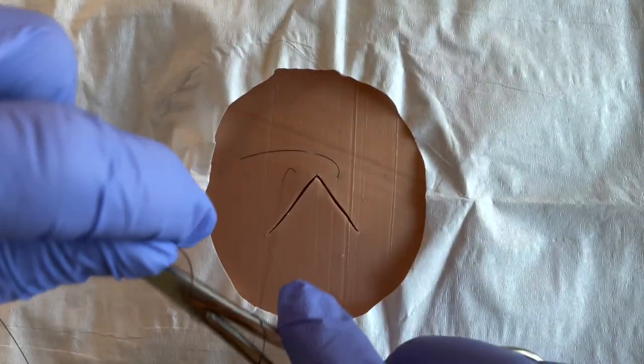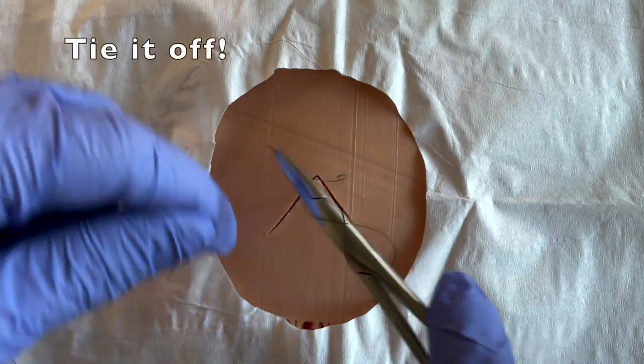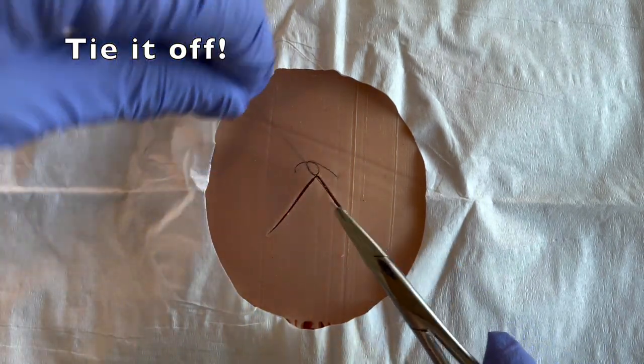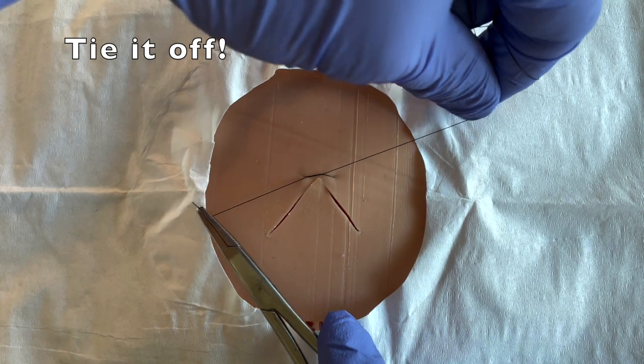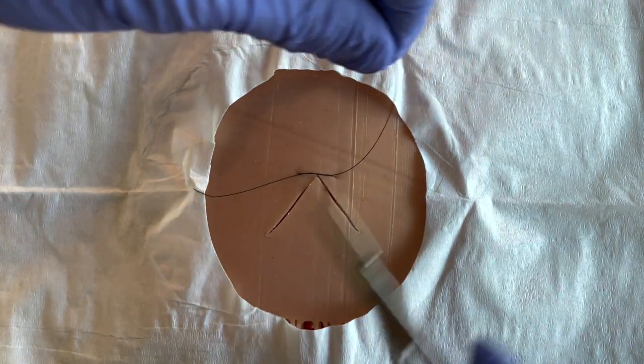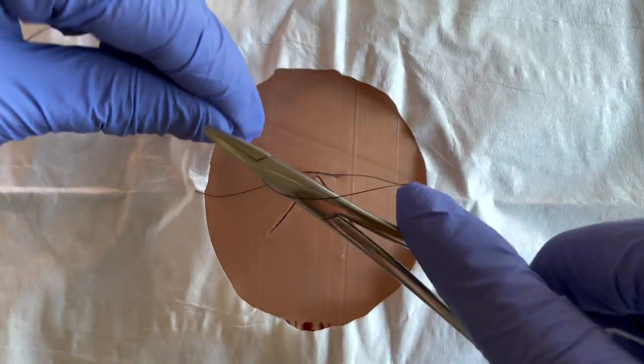So when it's time to tie it off, we'll bring this together nice and evenly and bring that flap edge together in order to approximate your margins.